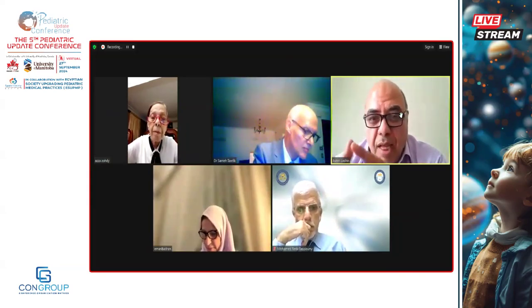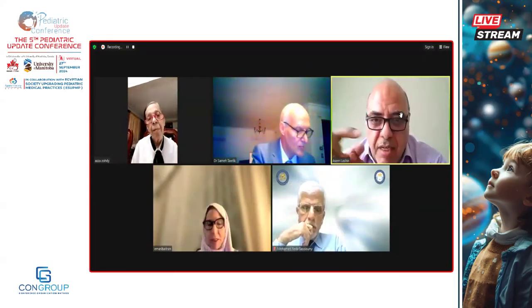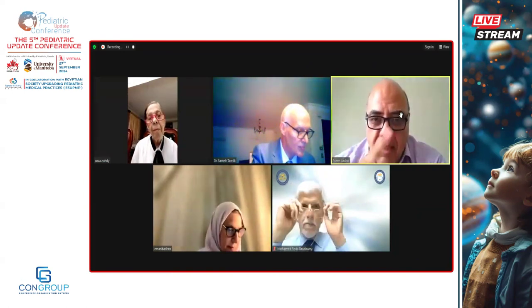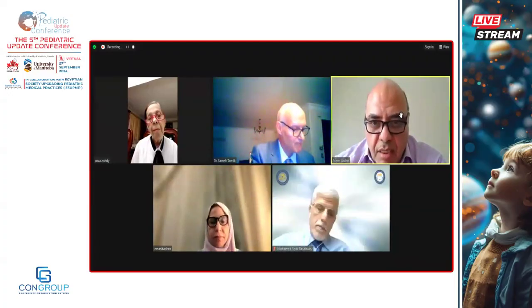But for the lung, we are using the linear one, and the same for the intestinal ultrasound, we are using the linear probe. So you can say the heart, the brain, the costophrenic angles with pleural effusion, and the liver with the curved probe, and the lung and the intestinal ultrasound with the linear probe.